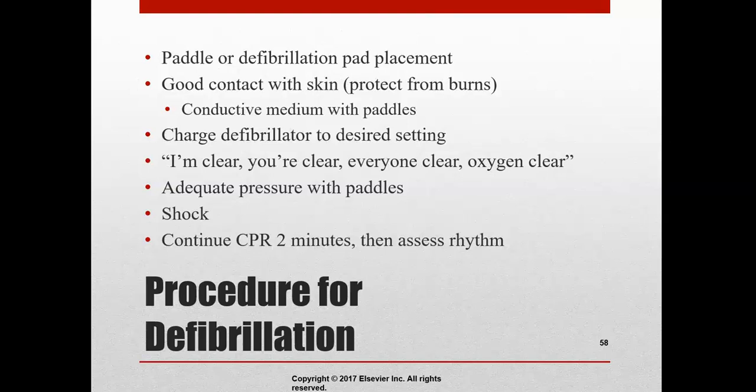We want to ensure safety. Obviously, it's always the most important thing. And this is an example of one mnemonic that may be used to ensure that no one person or oxygen is touching the patient during shock delivery. I'm clear, you're clear, everyone clear, oxygen clear.